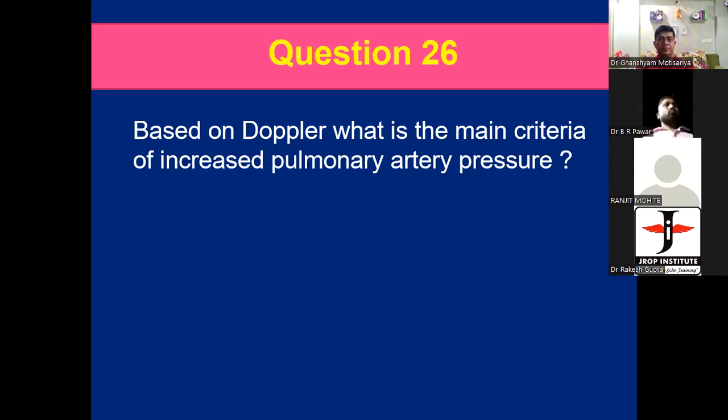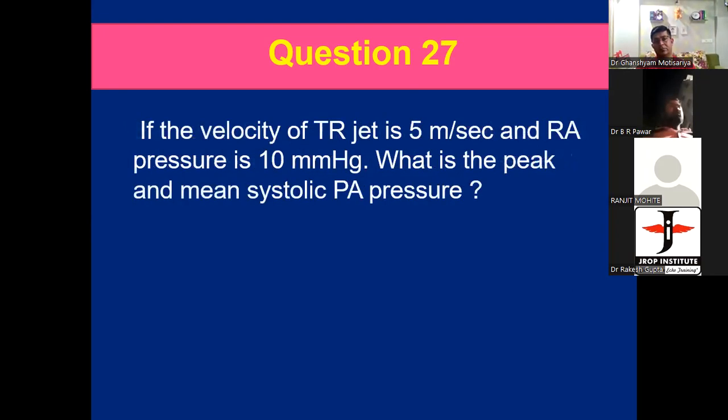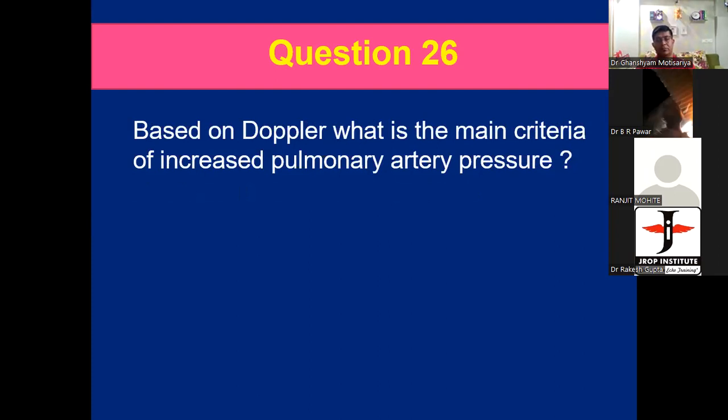So in this context, how do you calculate mean pulmonary artery pressure? By tracing the TR jet? No. I did not expect that from you, Jigna. The PA and diastolic pressure. No. Mean.